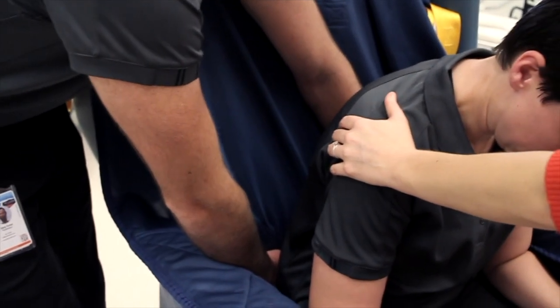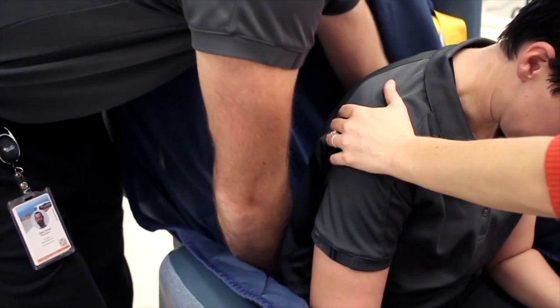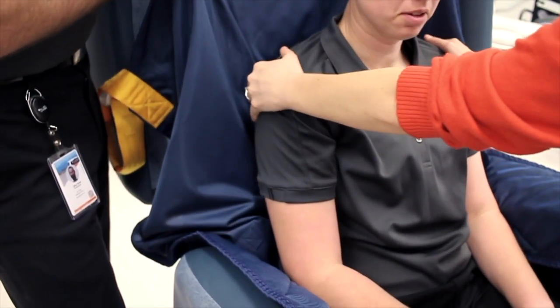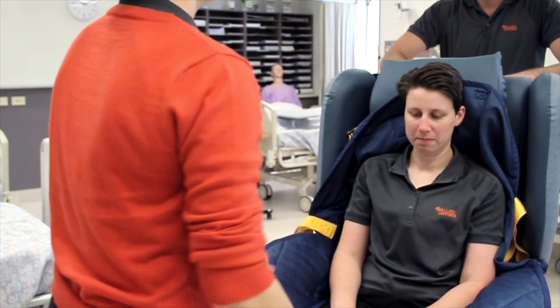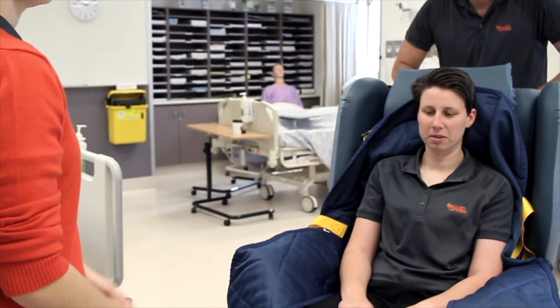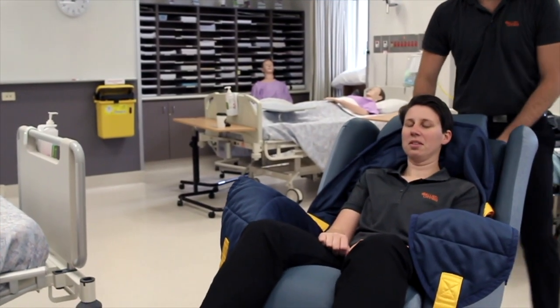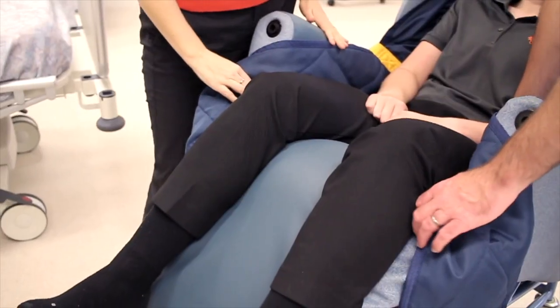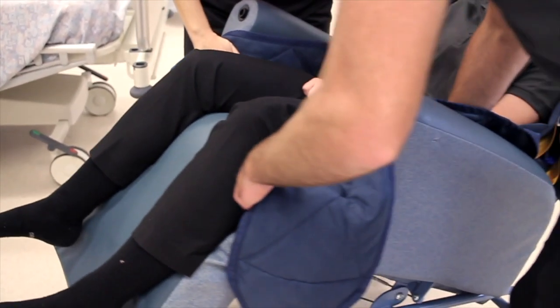A little tuck underneath the client will make sure that it's nice and smooth and will hold position. The client is then leant back to hold the sling into position, and then the chair — where it has a tilt-in-space function — is tilted posteriorly to support the sling into position but also take the weight off the lower limbs as they're manoeuvred into position to put the leg straps in place.